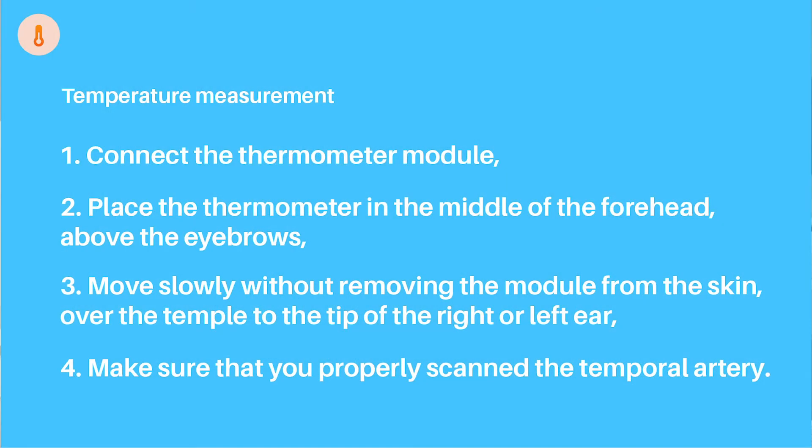Keep in mind these two points when measuring the temperature: place the thermometer in the middle of the forehead, above the eyebrows, and slide it over to the tip of one of the ears. The result is displayed automatically on the device's screen.